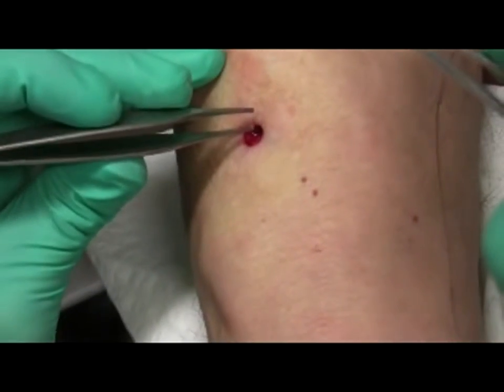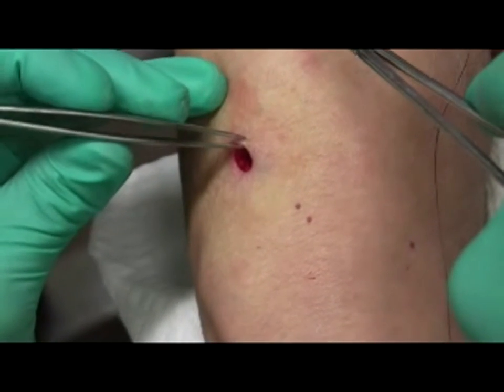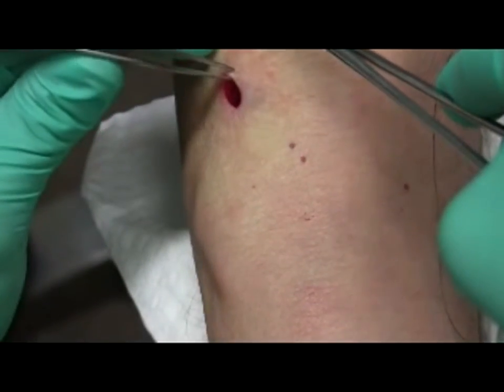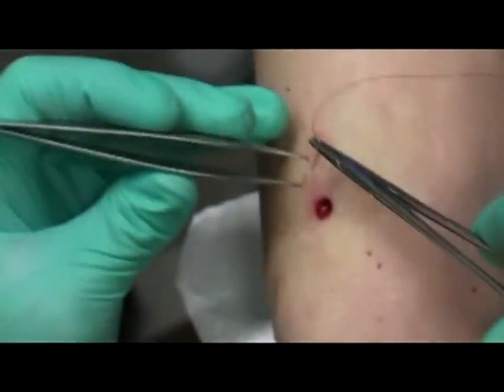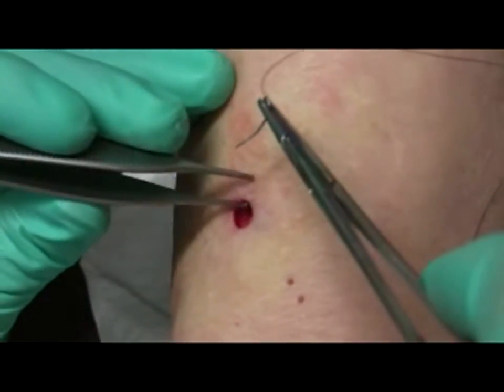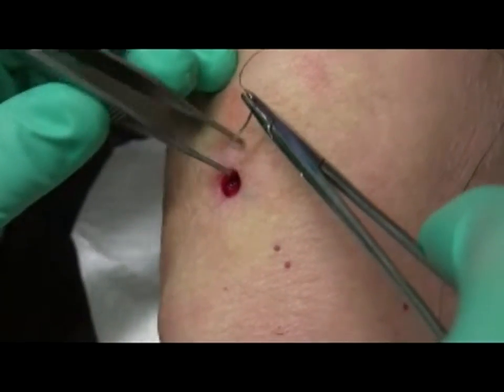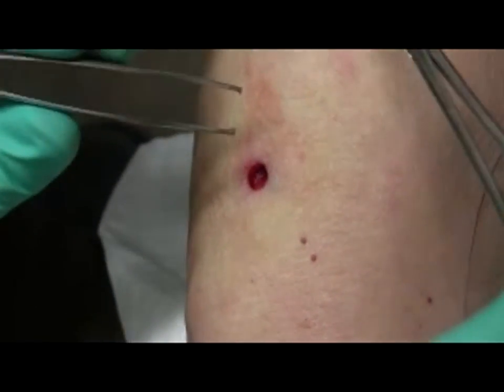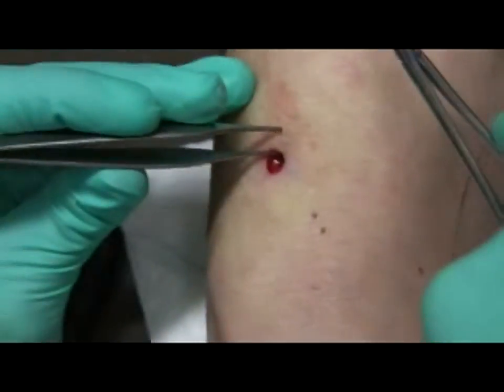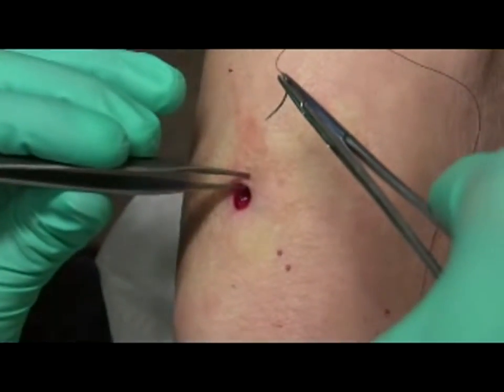Grab the wound edge gently with the toothed forceps. Using non-toothed serrated forceps will result in having to hold the wound edge too tightly, thereby crushing it. Here I'm very gentle — the hooks catch on the skin and I don't have to press hard. If there were no hooks, I'd have to push really hard and it would still slip, ending up crushing the skin. Also, the wound edge will continually slip out of the forceps grasp, causing blood splash and frustration.